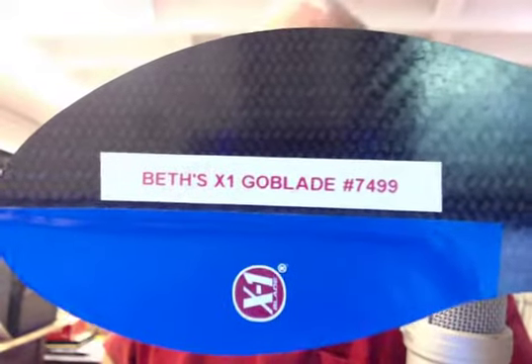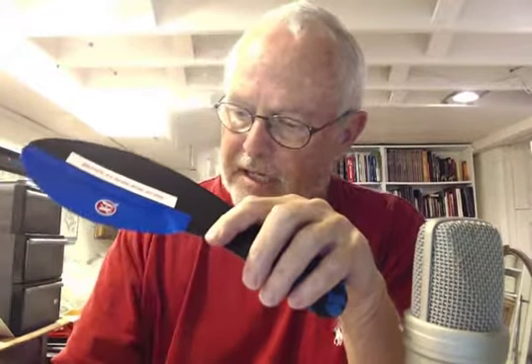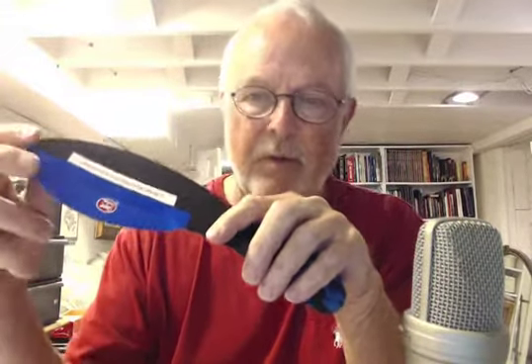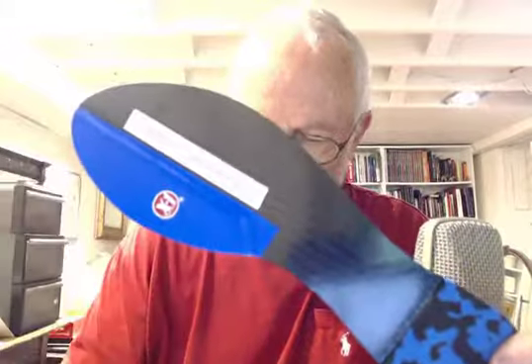It's ClydeIndianaBrace.com. This is Beth's X1 Gold Blade number 7,499, made for her today. It is 7/10/17, and she has arthritis in her big toe with a bone spur on her right foot. I made her a super light model. It weighs 0.987 ounces and it's three hundredths of an inch thick — super light and super thin, but tri-flex design.